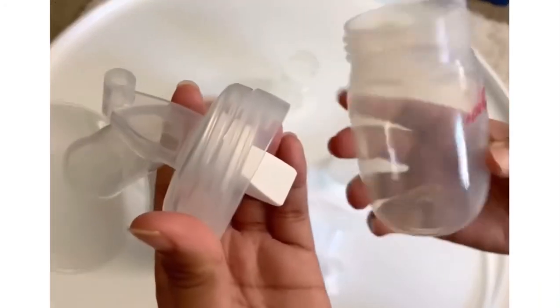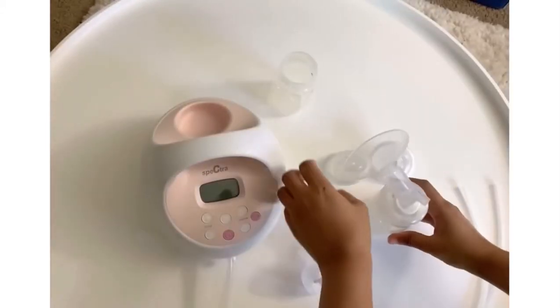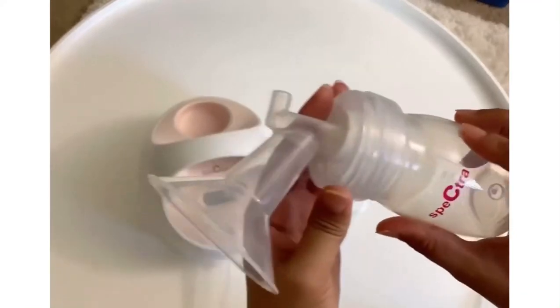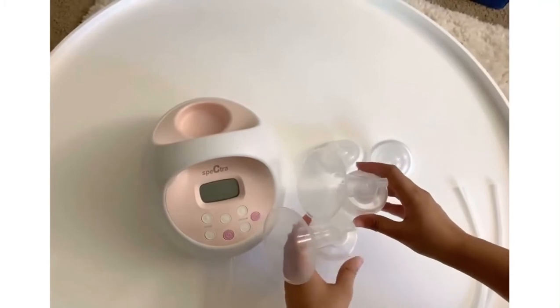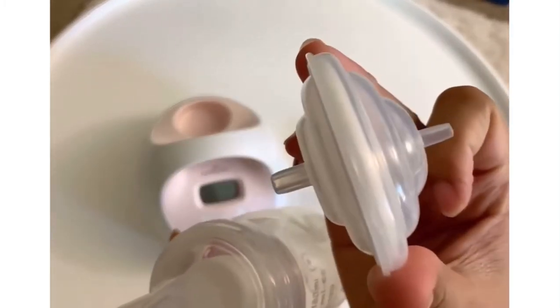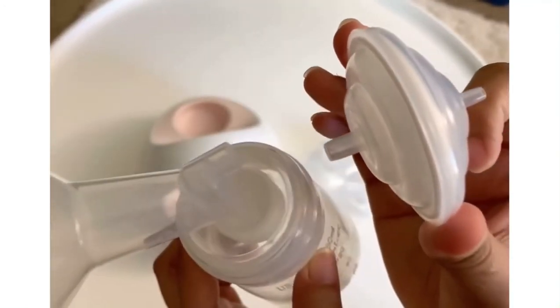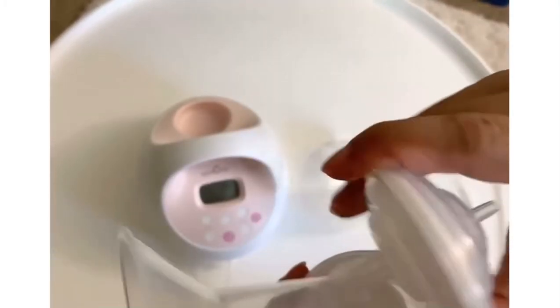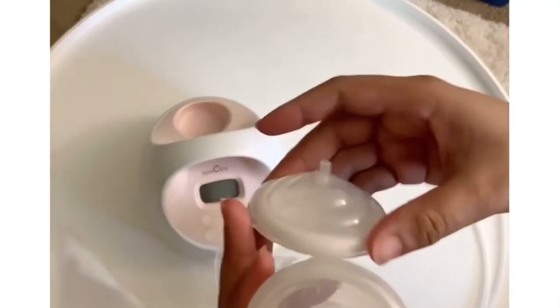Get one bottle and you just have to screw it on. Do the same with the other bottle. Next is to connect your backflow protector into the back of your flanges, and do it with the other one as well.